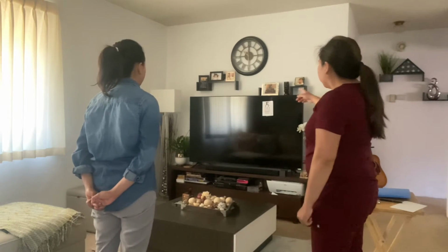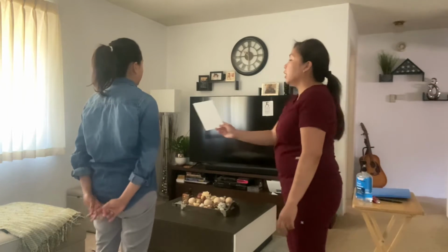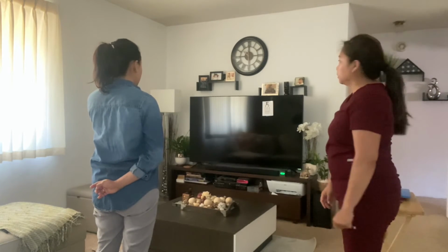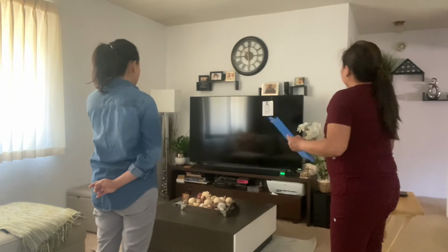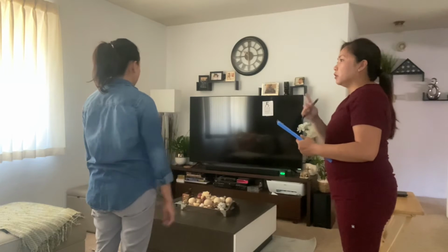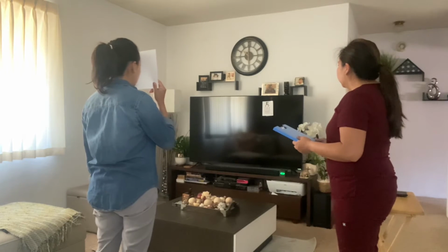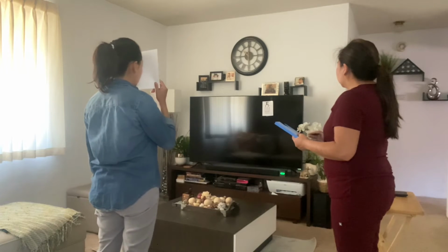I want you to please use this opaque card to cover your left eye, and then you can read the letters from the chart. E, F, E, T, O, Z, L, P, E, D, P, E, O, F, D. Alright, thank you. And please transfer the opaque card to your right eye, and just please verify the letters in the chart. E, F, E, T, O, Z, L, P, E, D, P, E, C, F, D.